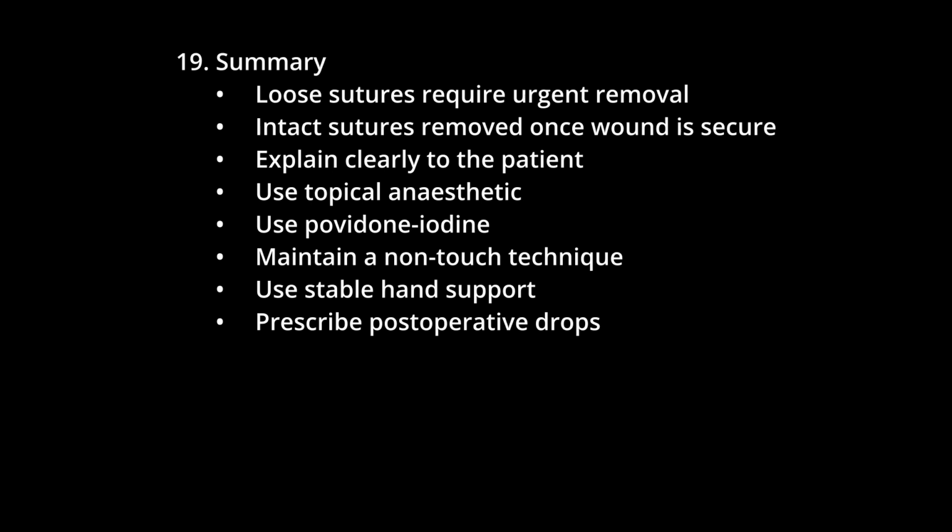In summary, loose sutures should be removed urgently because they cause discomfort, increase the risk of infection, and no longer support the wound. Elective removal of intact sutures is performed once the wound is secure enough to avoid later suture-related problems. Careful explanation to the patient, use of topical anaesthetic and povidone iodine, a non-touch technique in terms of the lashes, a stable hand support, and postoperative antibiotic drops are all essential.